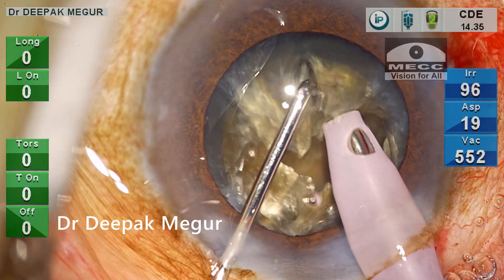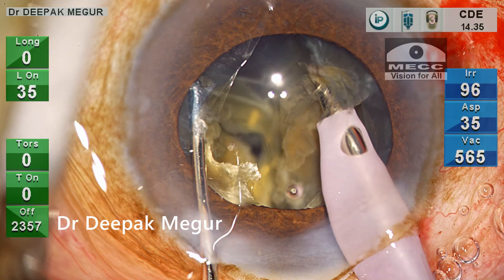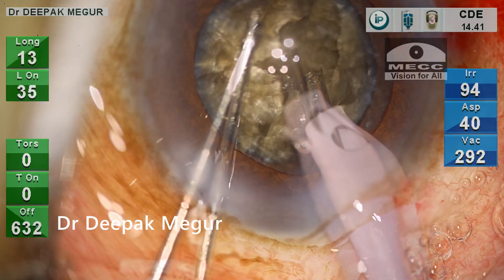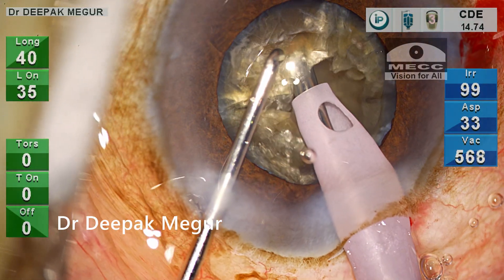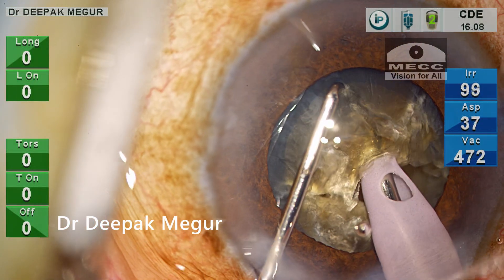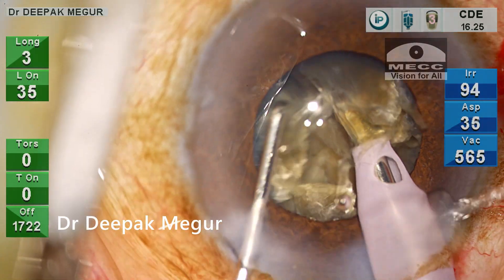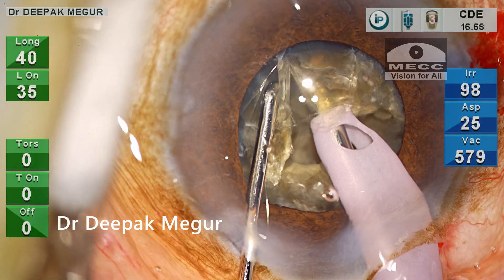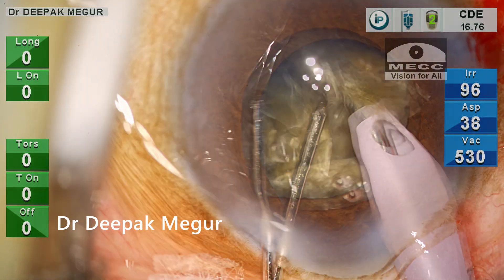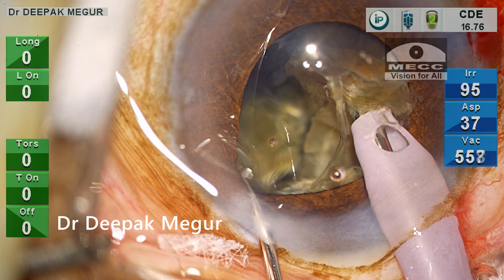While trying to chop at a deeper plane, I'm unable to place the second instrument due to lack of space. However, with persistence I manage to place the instrument deep enough, and during lateral separation the first complete separation of the fragment is finally achieved. I want to emulsify this free fragment now to create more space within the bag.